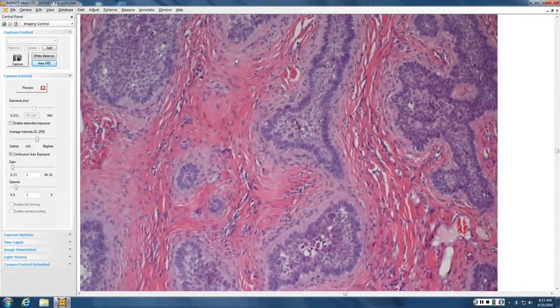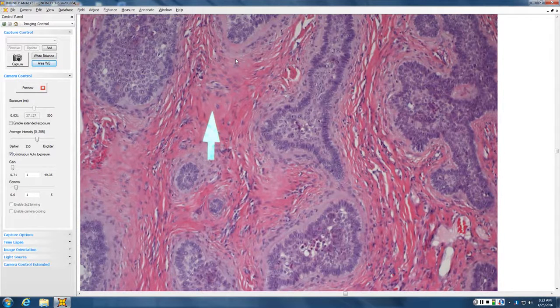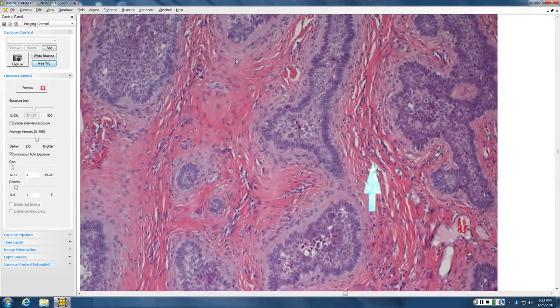But your stroma has big plump mesenchymal cells, which are your papillary mesenchymal bodies, and it's a concentric fibroblast-rich stroma with clefting within the stroma. So it looks like a pilar fiber sheath. So what would be a big benign pilar tumor that's not a basal cell? Pilar sheath acanthoma or trichoepithelioma?